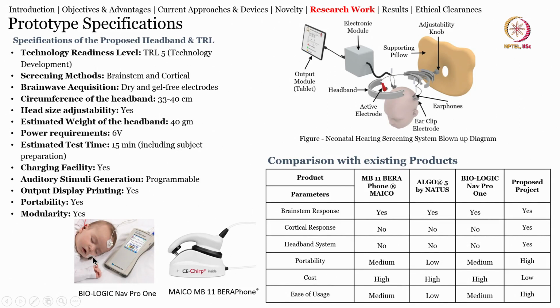You can see that putting patches at different areas of the baby's face is not really advisable, because babies' skin is very soft. Sometimes using tape also affects the skin. Okay. So, we need to be very careful about how to use the system. Now, this is a comparison of the parameters we can look at.